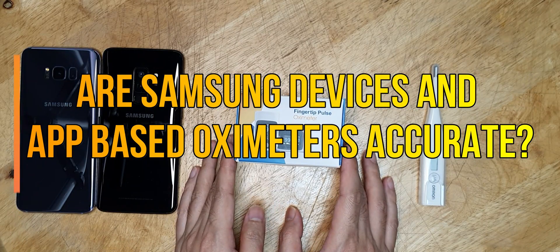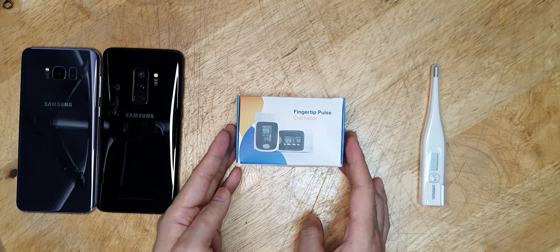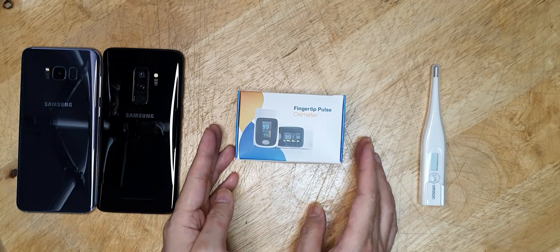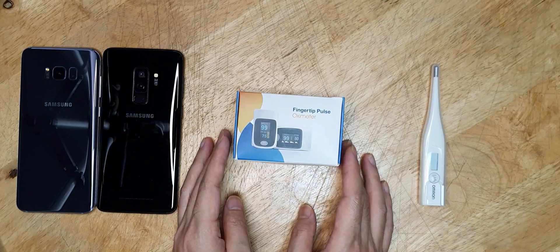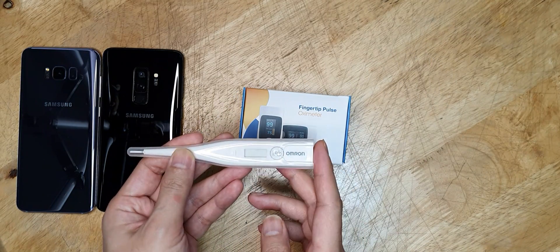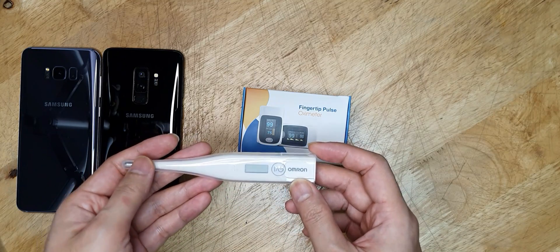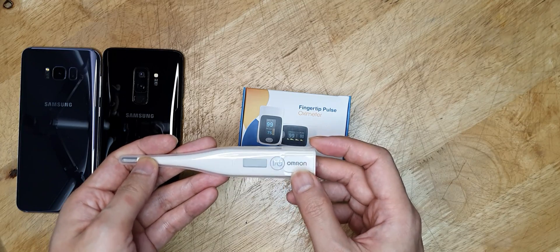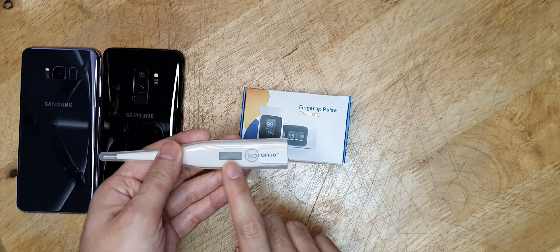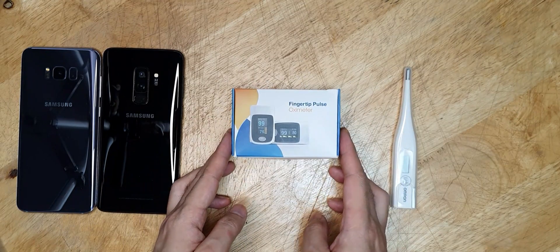In my last video, I covered the fingertip oximeter for measuring the SpO2, or the oxygen level in your blood, which is supposed to be an indicator of the coronavirus illness seriousness. I will reiterate my advice that we should be using the thermometer first to detect your body temperature, because body temperature is one of the most important symptoms of coronavirus illness. We should stick to the thermometer first, and if you get many symptoms of COVID-19, then you can measure the blood oxygen level.